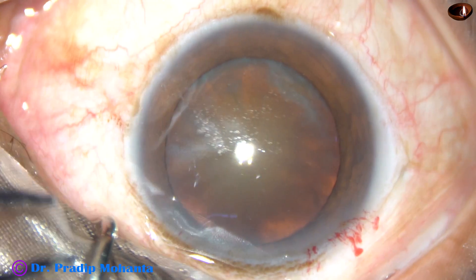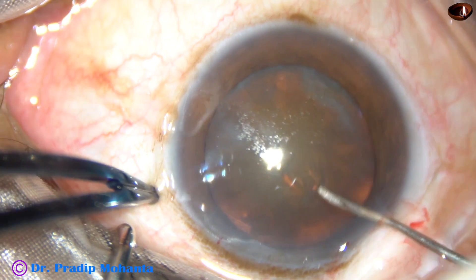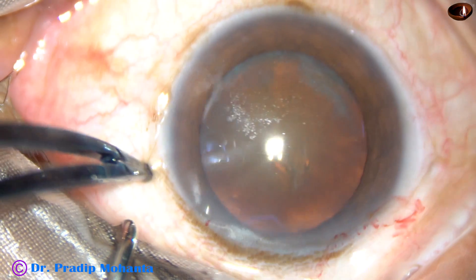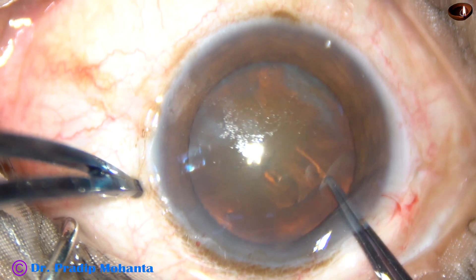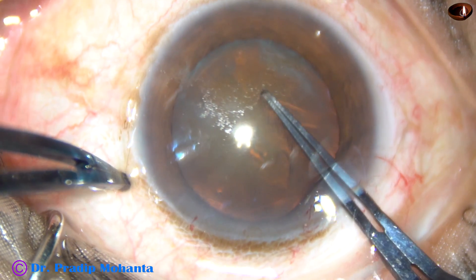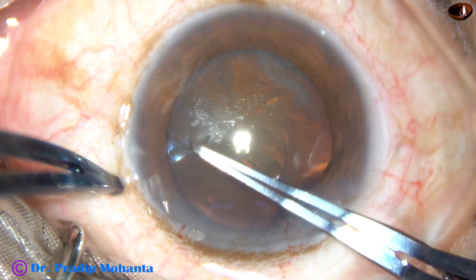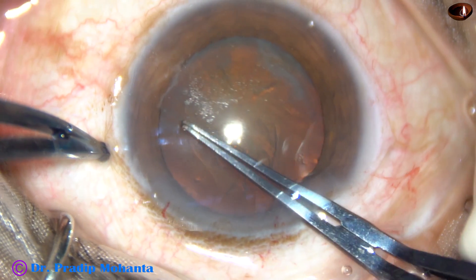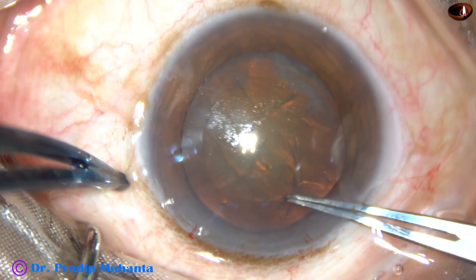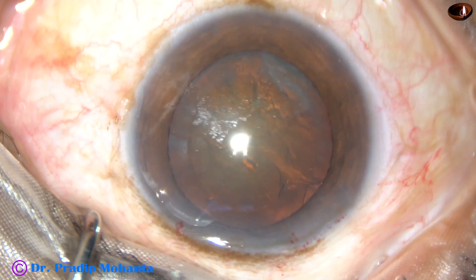Now hold on the other side, incise the capsule, and raise a flap. Use Utata forceps, go all around and do a continuous curvilinear capsulorrhexis. You can use some viscoelastic substance over the corneal epithelium — it improves visibility.